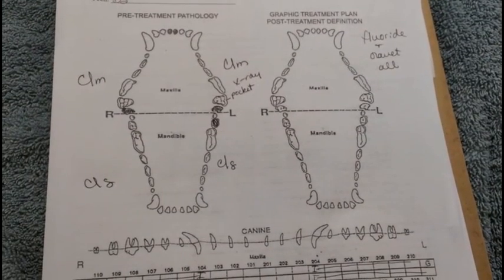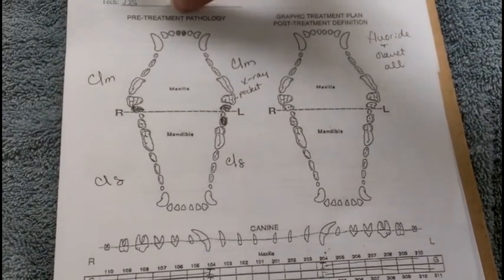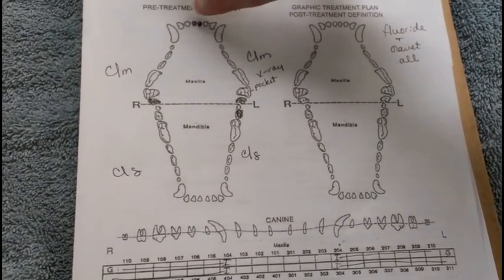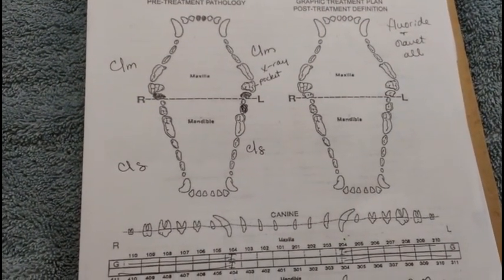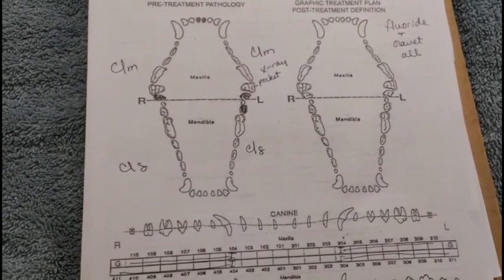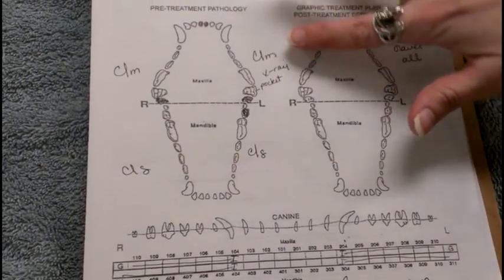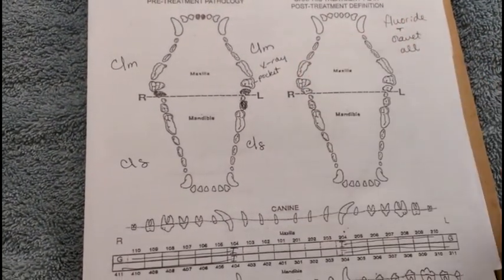So this is our completed dental chart for Mabel. We have a before side, or pre-treatment, versus the after side, or after we clean the teeth. On the before side, you see there's a couple of teeth colored in. Those are teeth that she was missing when we started the dental, that either she didn't have or were pulled out previously for a reason. We grade the calculus and tartar buildup. She had a moderate calculus tartar buildup on the top. The bottom wasn't quite as bad.